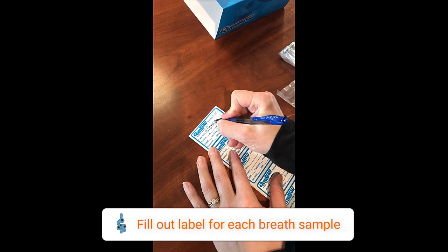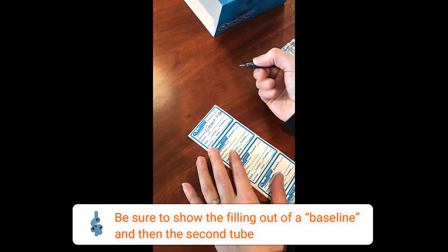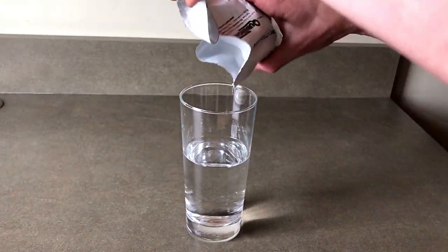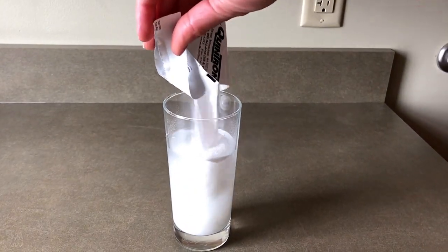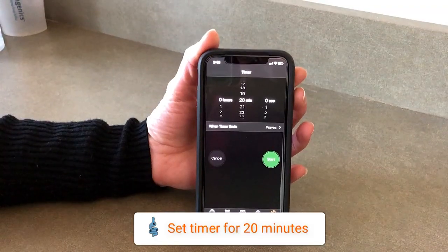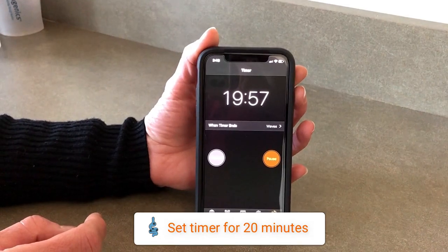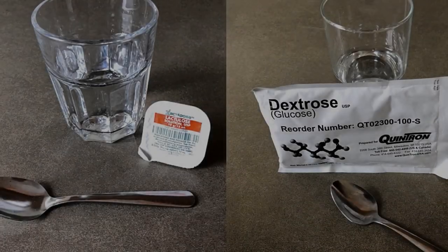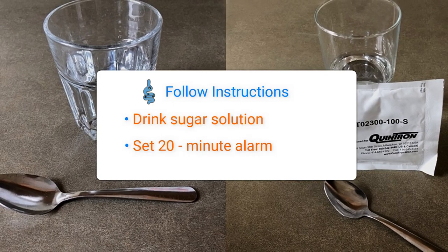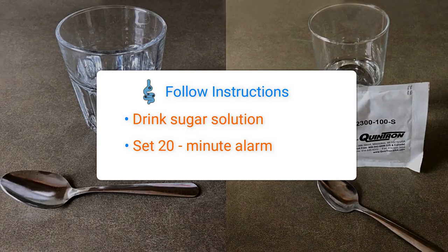After each breath sample collection, fill out a label including the specimen number and time collected. Once your baseline breath sample is collected and label completed, you can now drink your test solution sugar substrate and set your timer or smartphone for 20 minutes. Neurovana offers a variety of sugar substrates — please follow the included directions that detail the amount of water required.